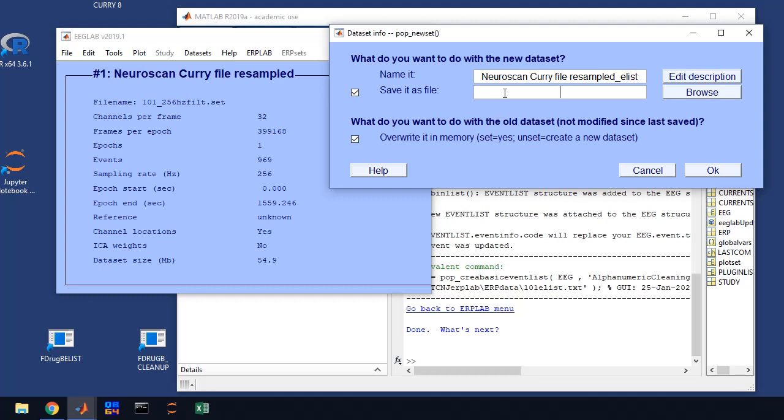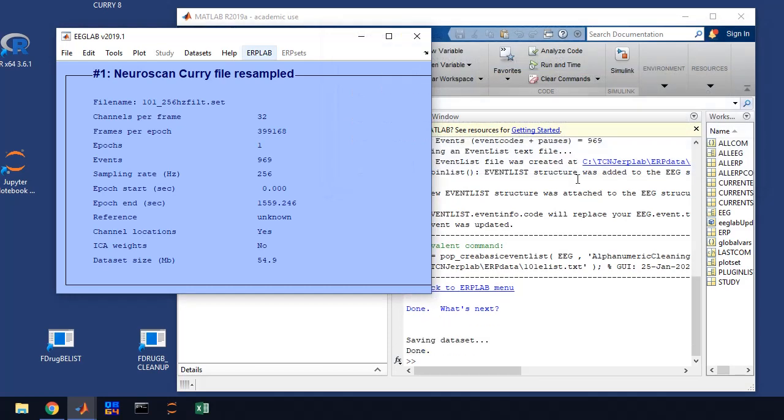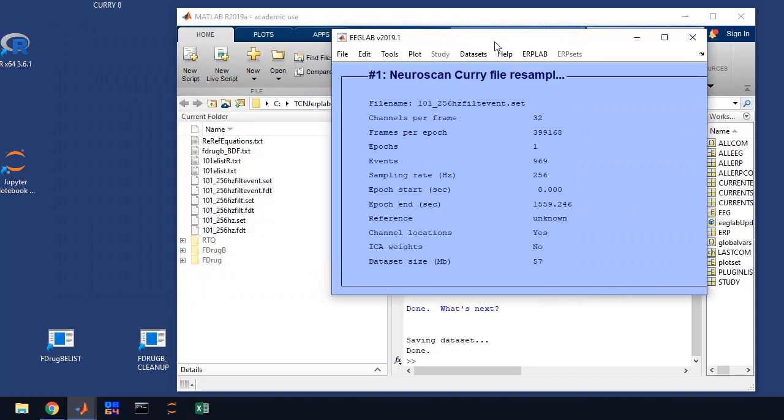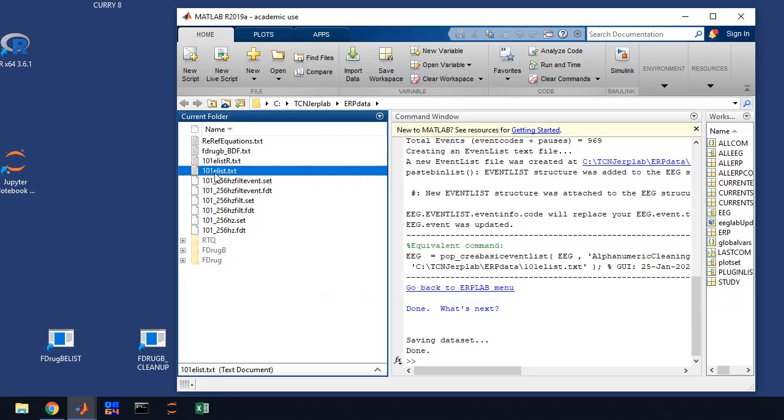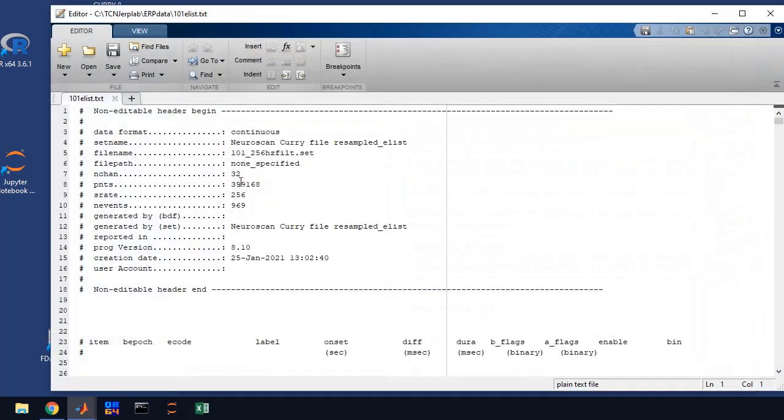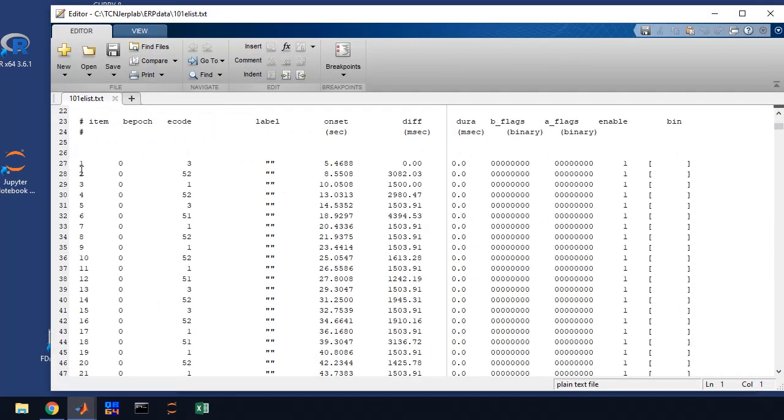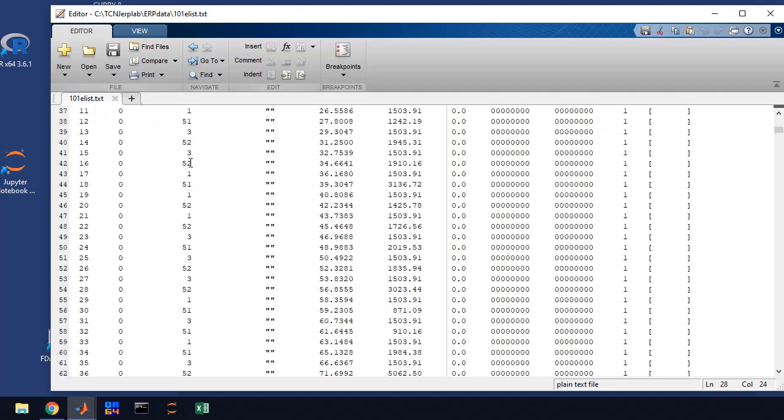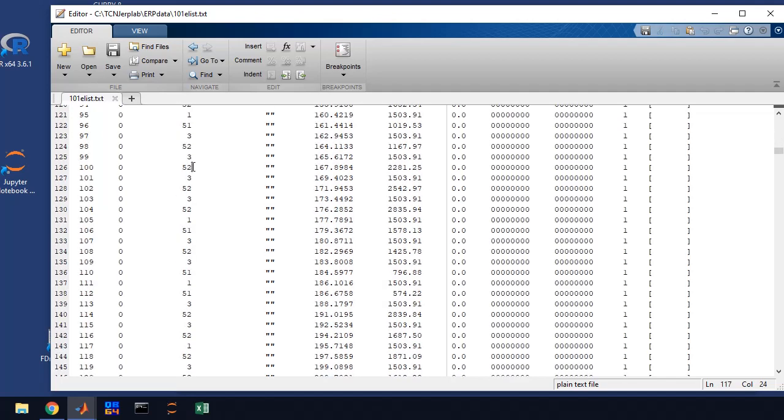So first let me save it and I'll show you what that file looks like. So 101, 256 hertz, filtered, but now we've added events. So we're going to add the event there and click OK. So let me show you that event list. So if you notice over here, you have 101 elist. That's what we created. So if we double click on it, what we get is we get a listing of each event code. Those were the little bars or that's the communication from our recording computers. And we have a code for what the trial type is and what the response was and so on.